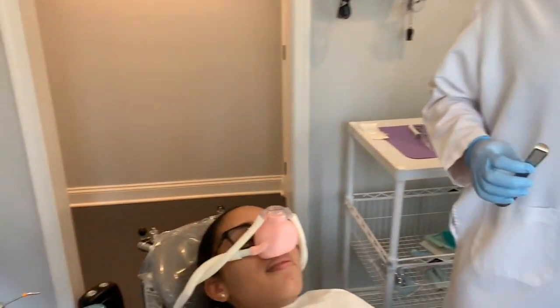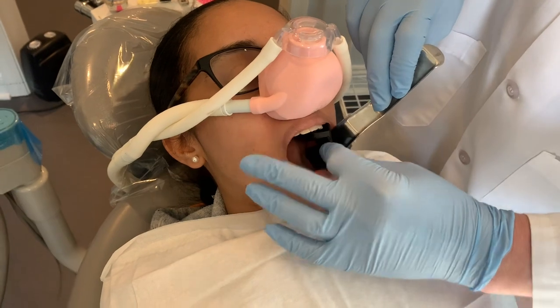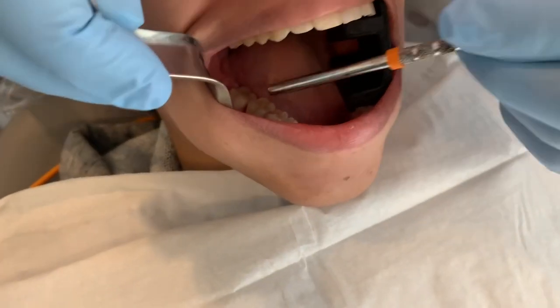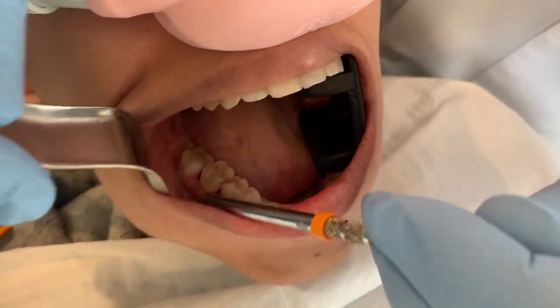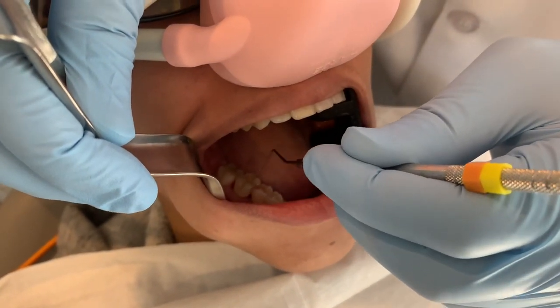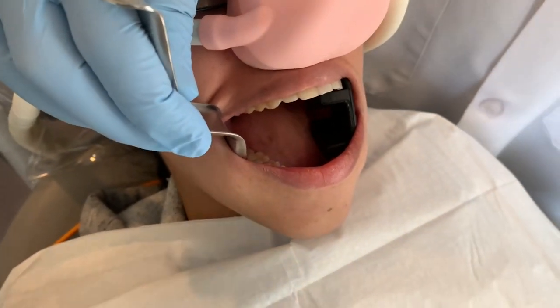Like I said before, step one is to cut the tooth into two pieces. Let me see that bite block. I will typically give the patient something to rest their teeth on. Is that okay? Mm-hmm. Okay. And open big. Good. And just to orient everybody, this tooth right here is tooth number 30. And so what I'm going to do, since this tooth has two roots that kind of look like this, I'm going to separate the tooth into two pieces, and I'm going to cut it front to back here, and then we can easily take it out like two splinters rather than trying to pull it out in one big piece, which would be much more traumatic.